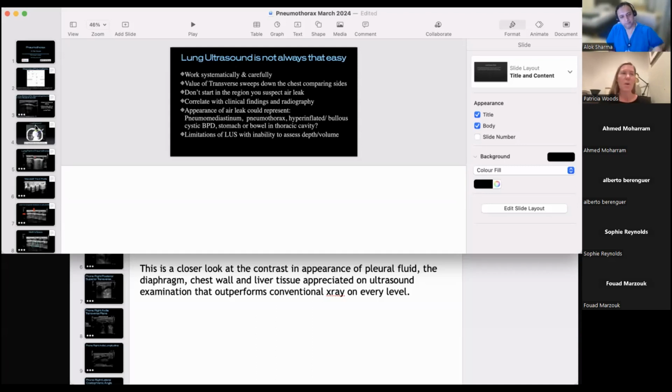Yeah, that's absolutely right. So remember, everything below the pleural line is artifact. I do it a lot for teaching when I'm trying to demonstrate, say, coalescent B lines or intermittent B lines. We play with the depth to start with to show you it goes on and on. But keeping, the way I've set our machine, a default is around 2.5 centimeters. But I think that's to help you anchor the slide, if you like. So there's always some reference to a physical structure.